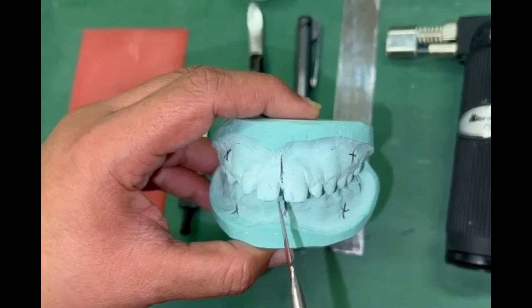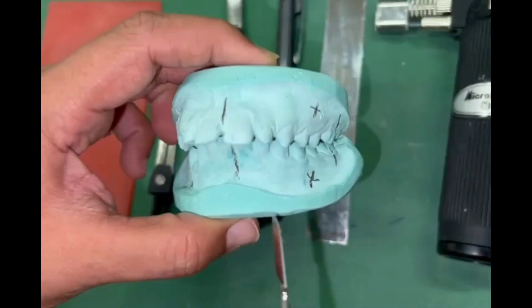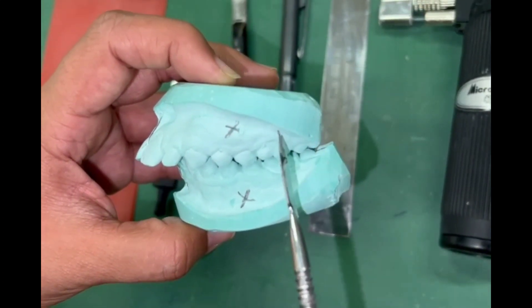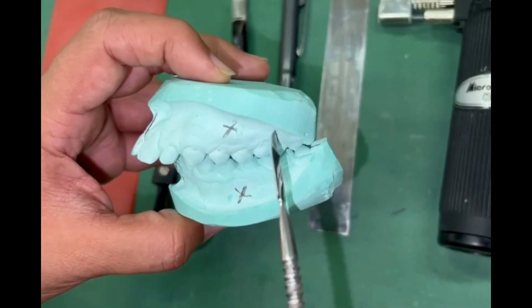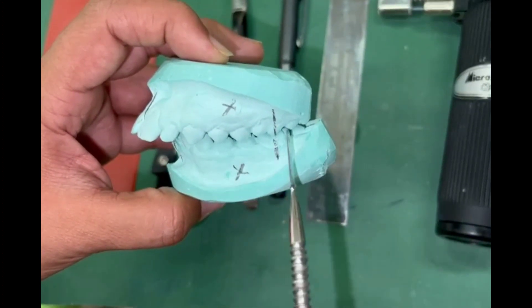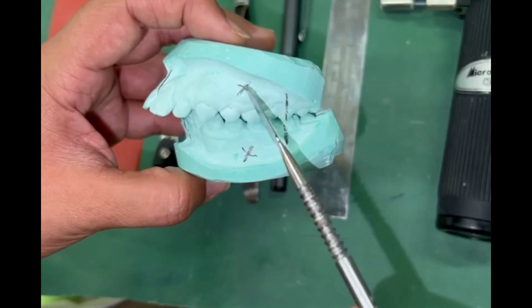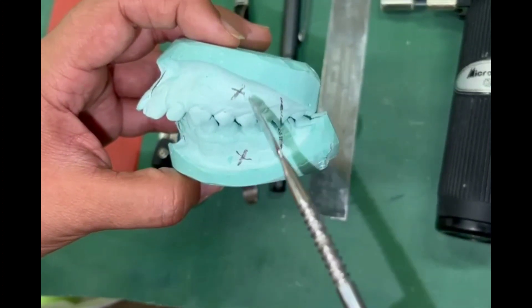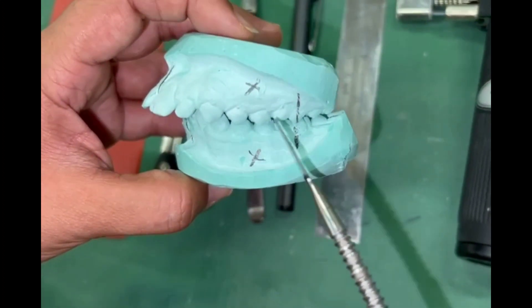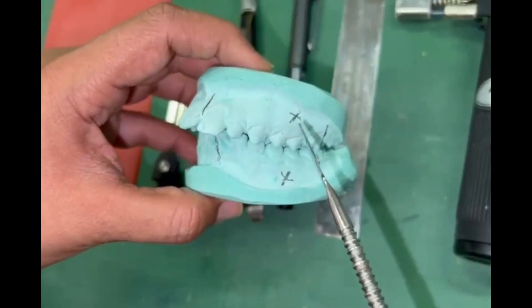The study model should have markings of the upper midline and the lower midline. You can mark either the mesiobuccal cusp or the distobuccal cusp, and a vertical line which should pass from the maxillary to the mandibular arch so that we can measure how much horizontal advancement is being done during bite registration. Also, two vertical points need to be marked so that one can measure the amount of bite opening done during bite registration, and this should be done bilaterally on both sides.